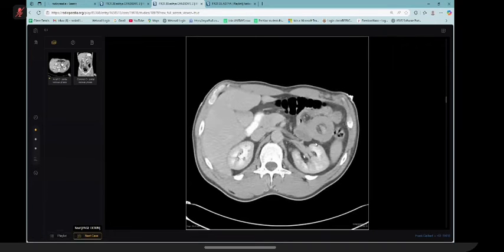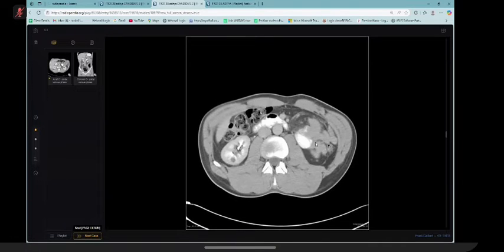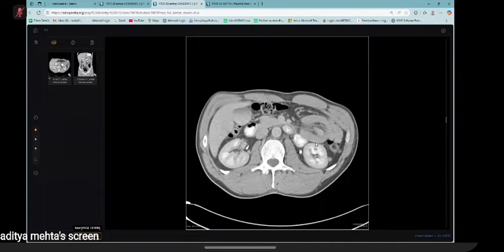As this is an emergency, first I will pick up my phone and inform the referring physician about the finding. I will suggest referral to the surgical team, and further suggest referral to the gastro-onco MDT. I would also suggest staging CT and PET CT in this case, and I would like to see the bone window available in this case.